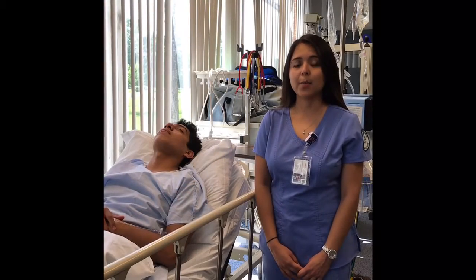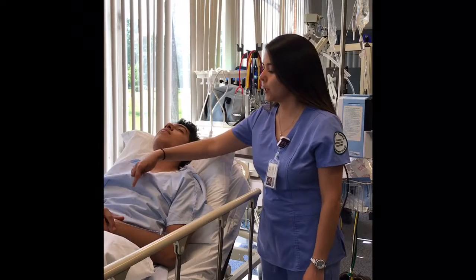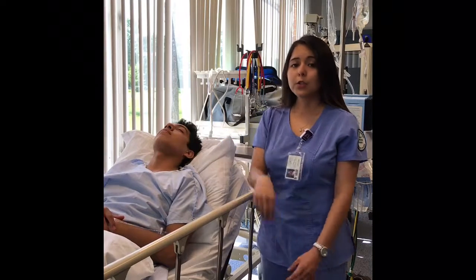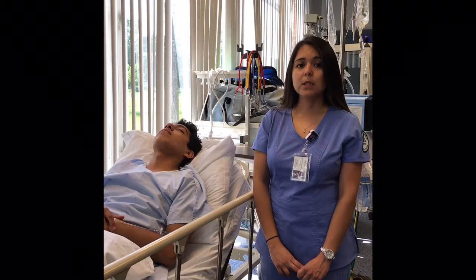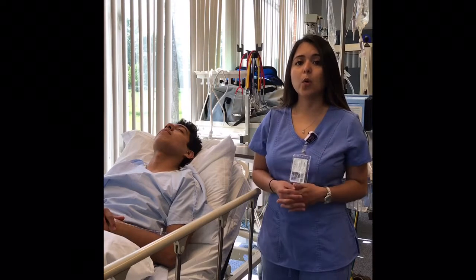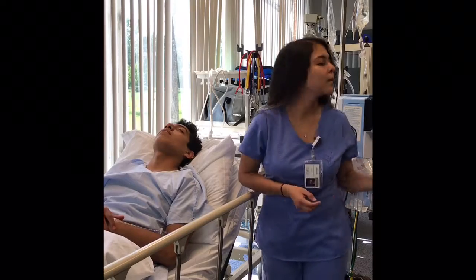Indications for IS therapy include upper abdominal surgery, thoracic surgery, surgery in patients with COPD or a smoking history, the presence of pulmonary atelectasis, or restrictive lung defects.